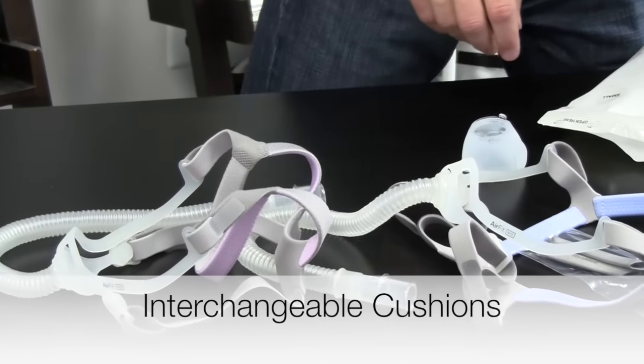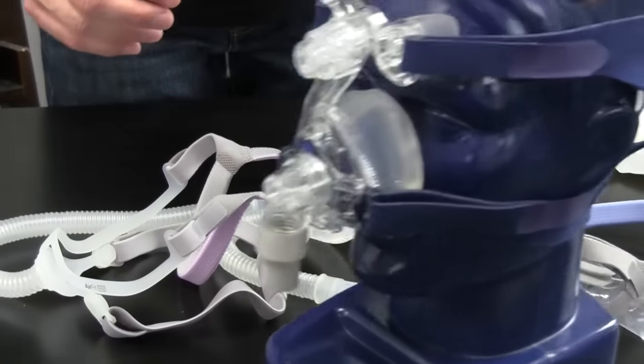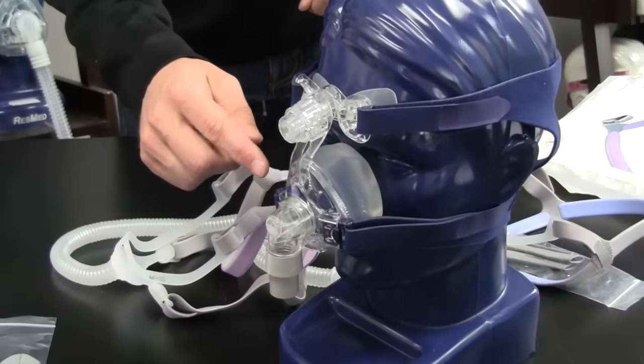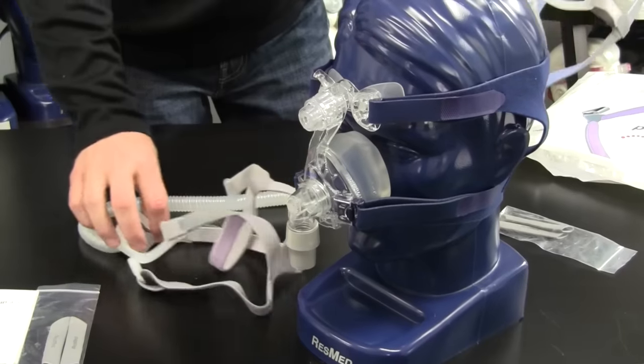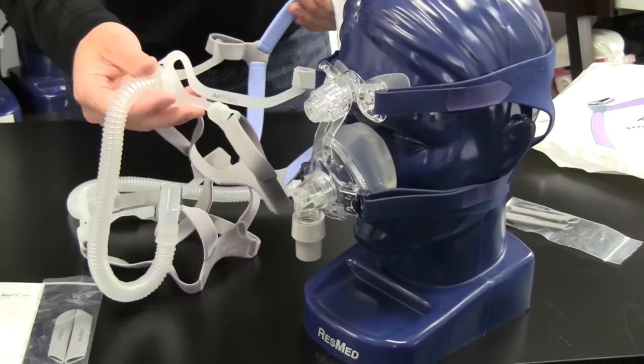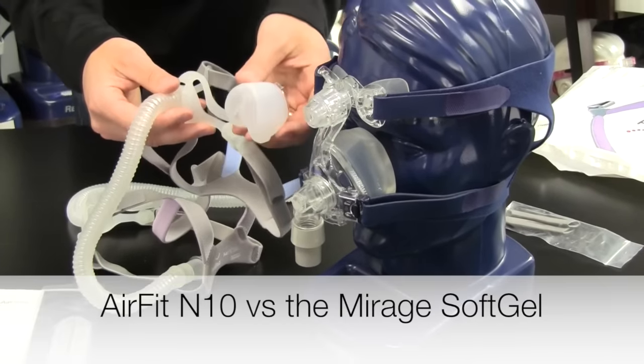To give you an idea, this is one of ResMed's older masks. This is called the Softgel. Although it's a very good mask, you can see the difference in size. And here's the AirFit mask. The cushion's so much smaller.